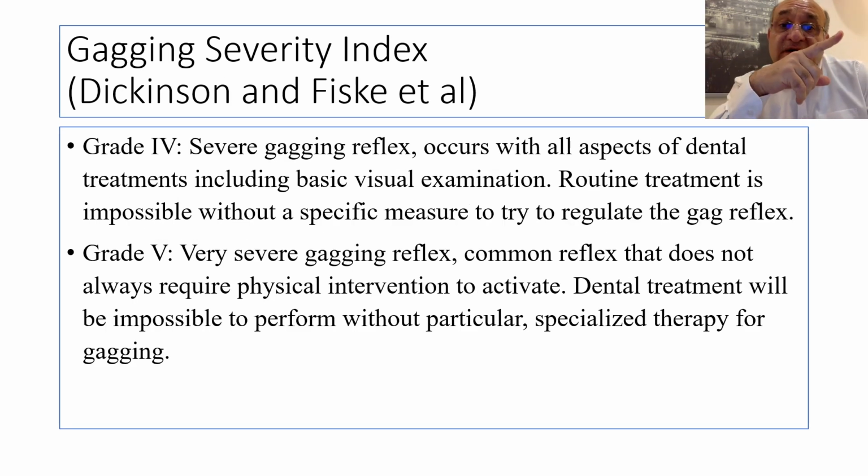Grade 4 is a severe gagging reflex, and it occurs with all aspects of dental treatments, regardless of severity, including even the basic visual examination. Routine treatment sometimes is impossible without a specific measure to try to regulate the gagging reflex.